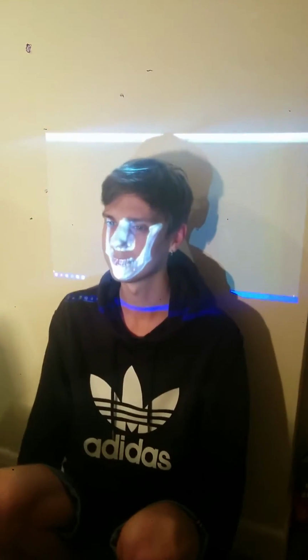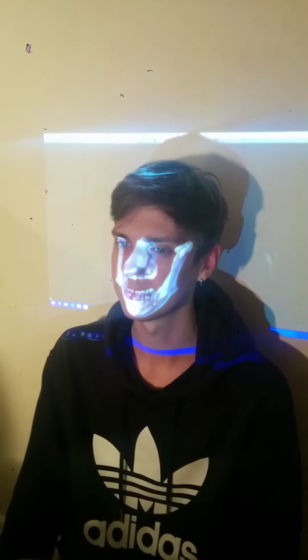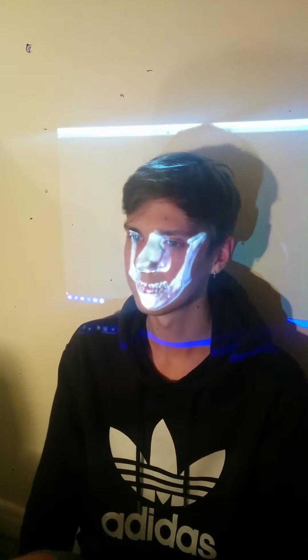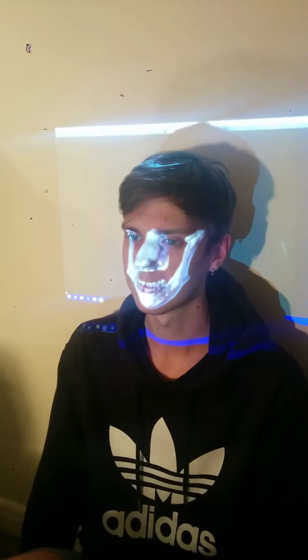There you go. And you can see that the Kinect has now managed to map the STL file onto the patient's face. If the patient now turns his face to the left slowly, you can see the Kinect file is also turning corresponding to the patient's movement.